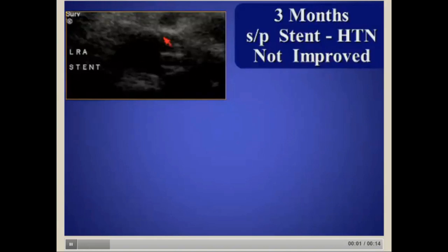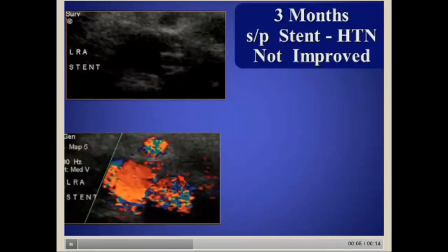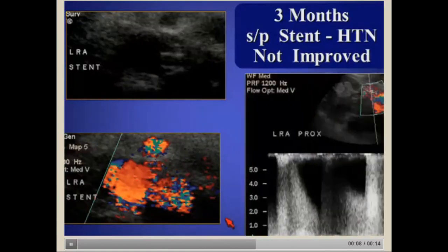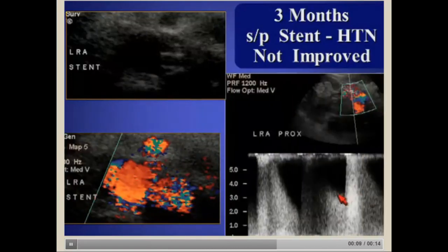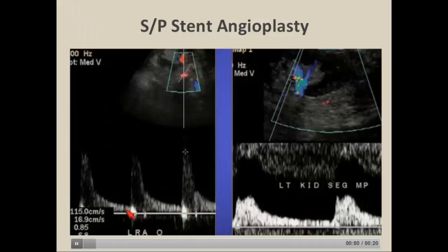Here was a patient with a renal stent placed whose hypertension did not improve. Color Doppler showed a bruit artifact overlying the stent with velocities over 500 cm/s where the stent wasn't placed properly. After stent revision, the peak systolic velocity returned to the normal range with a normal hilum waveform.